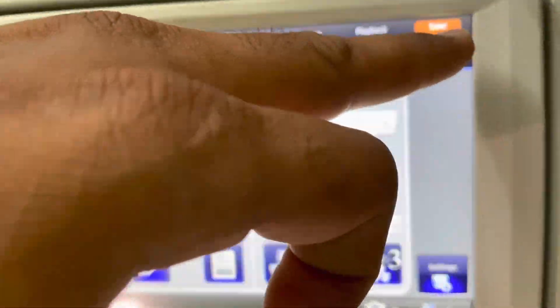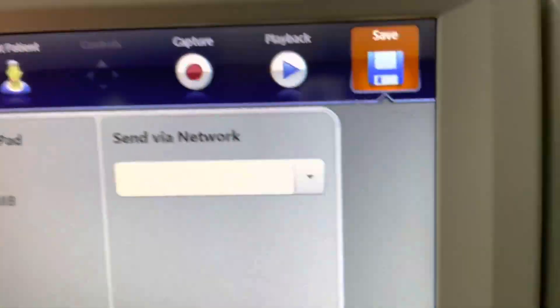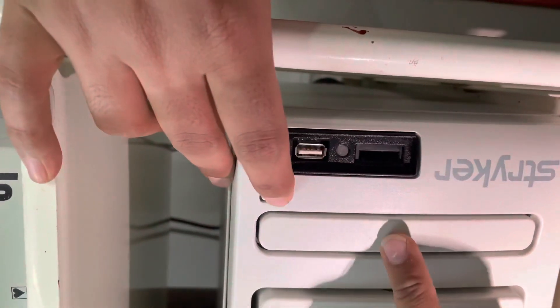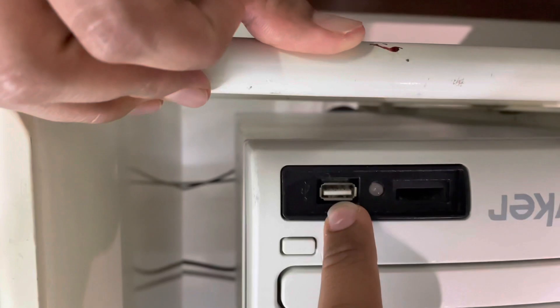After reviewing, you can save the videos and photos you captured via disk, via USB drive, or you can send them via network. This is a CD drive — you can insert a disk to save your recordings. You can also insert a pen drive here to take all your content.